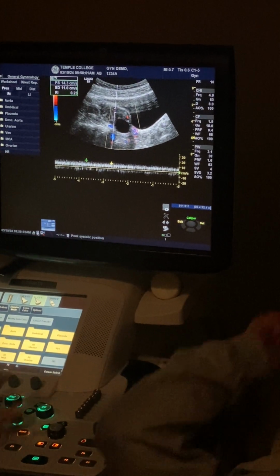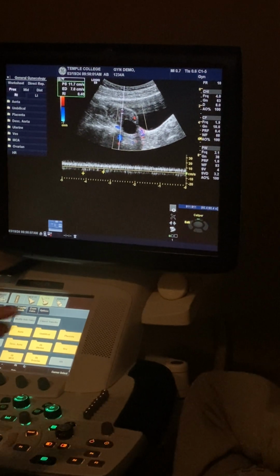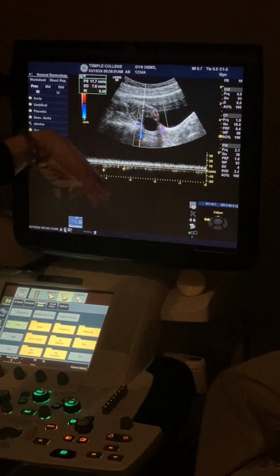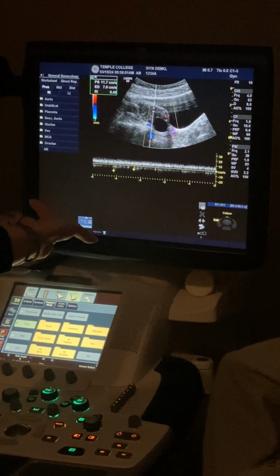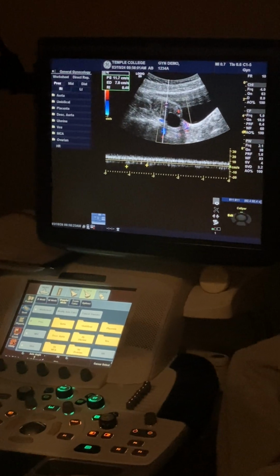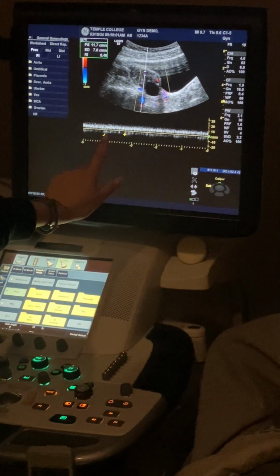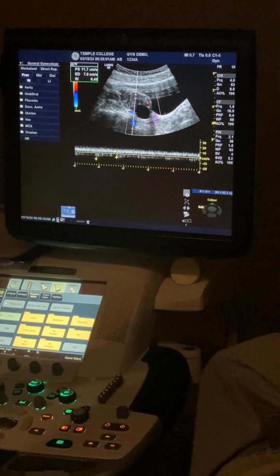It's a little bit lower velocity here. And it's okay if it's on the bottom because those vessels kind of like are spidering all out into the organ. So you don't need an angle. You don't need to change and flip-flop and invert anything. It's fine if you leave it like this. But y'all saw the difference in that really sharp up peak or upstroke in the velocity when I got the tube, and now this is a little bit lower and lower resistance, so our peak and our diastolic are a little closer together. So that's going to tell you the difference between a tube and the ovary.